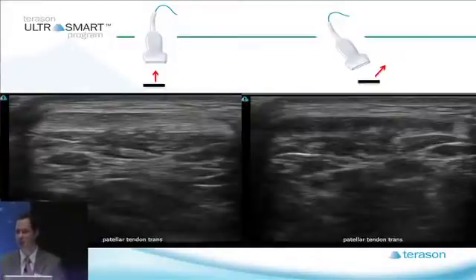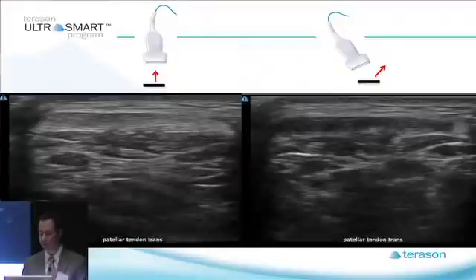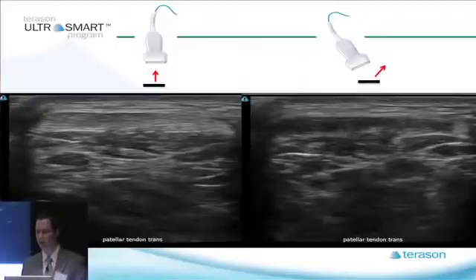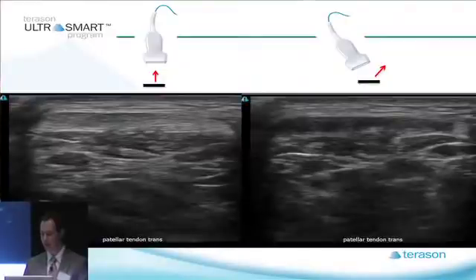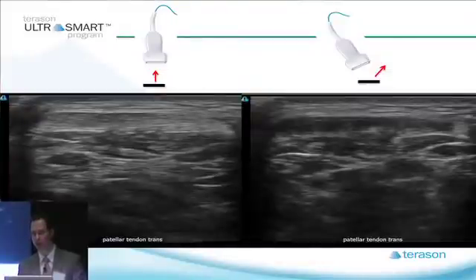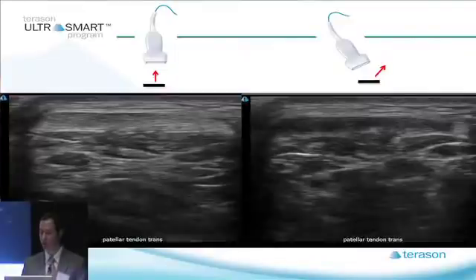It doesn't take much. For a tendon, it probably takes 15 degrees of angulation before you start getting this anisotropic effect. So that patellar tendon is the same patellar tendon within a second of the other picture — the only difference is that the transducer is angled. This does a couple of things: one is it could make you think that the patellar tendon is pathologic.